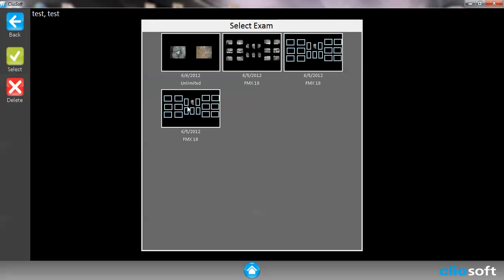Once we choose View Exam, you'll see that there are multiple exams. The exams are saved by date and what kind of image was taken. For example, this one was using the intraoral camera and the layout was unlimited. This one was using the sensor images and the layout is FMX. It will keep going on for however many exams that you have.